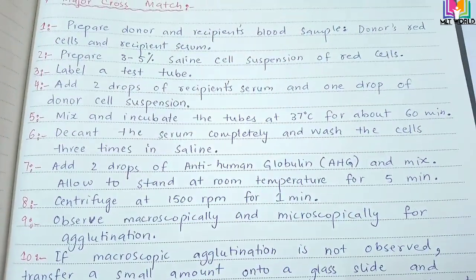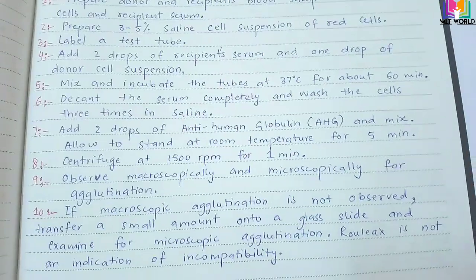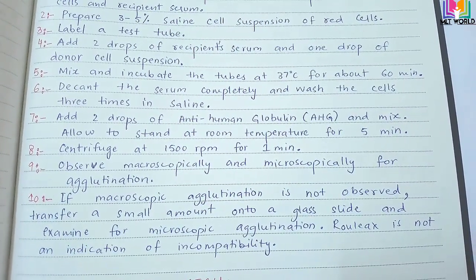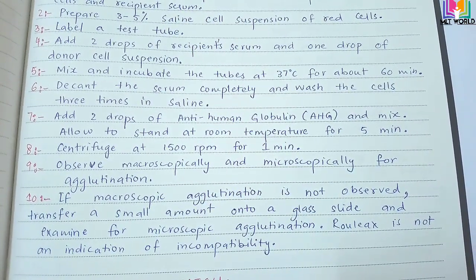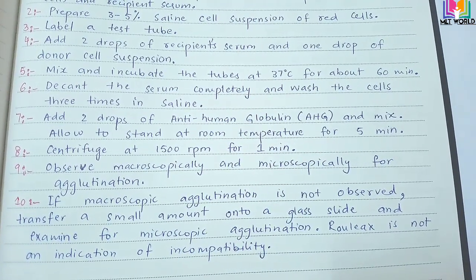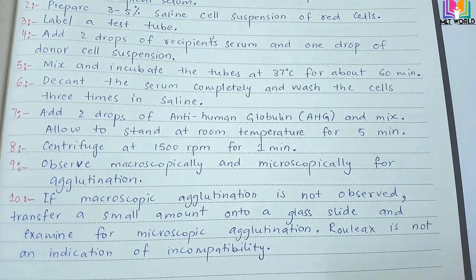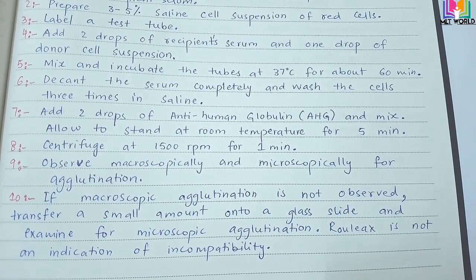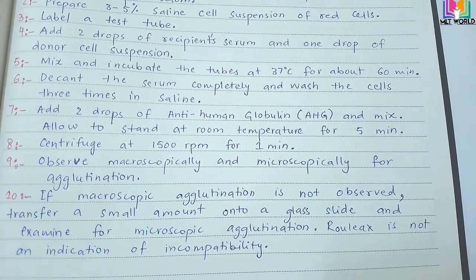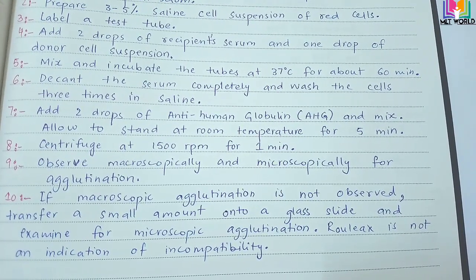Now you have to label your test tube with the patient name. After that you add 2 drops of recipient serum and 1 drop of cell suspension, and that cell suspension is the donor cell suspension. So in the tube you will add 2 drops of recipient serum, so the recipient serum quantity will be double, and 1 drop of cell suspension. After that mix and incubate the tubes at 37 degrees centigrade for about 60 minutes.